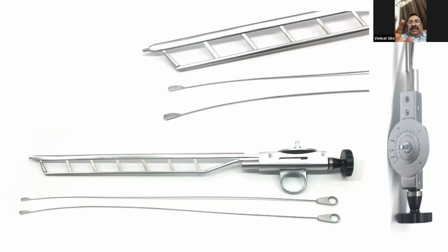So don't confuse Otis urethrotomy with VIU. Otis urethrotomy is totally different. That will cut 3 millimeters, agreed. In VIU, up to what level will you cut? When you say yes, it's okay.